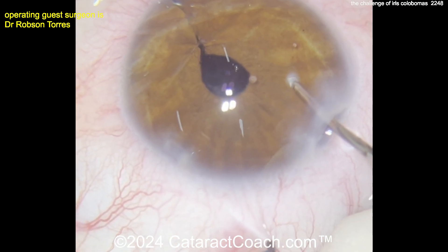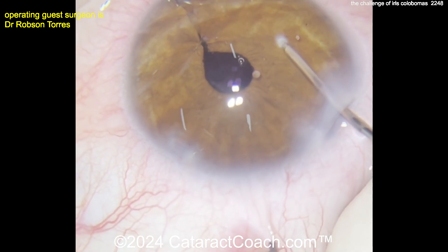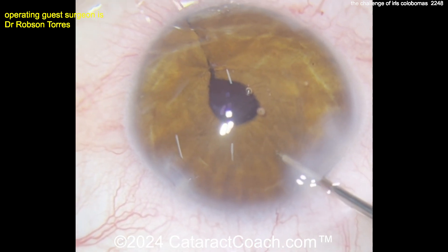This patient is going to have a beautiful result — he's going to be very happy. The surgery fixed the cataract, likely fixed the majority of the refractive error, fixed the coloboma, and centered up the pupil.